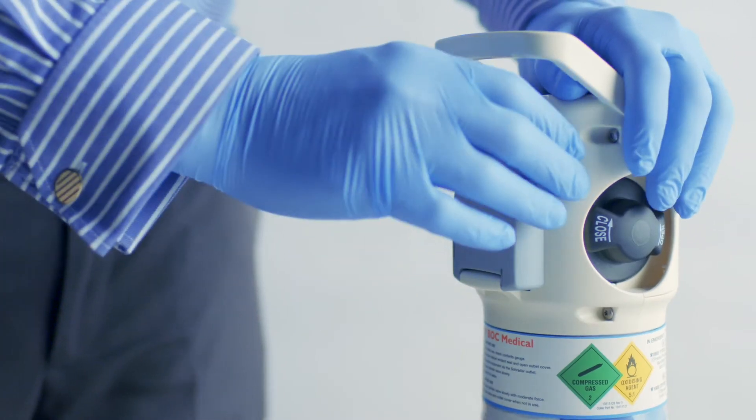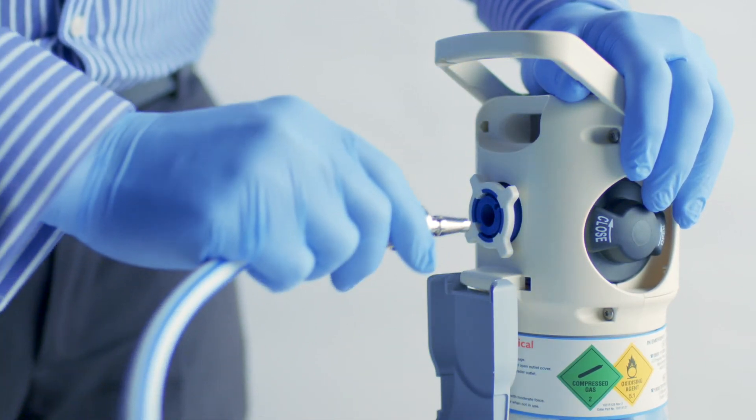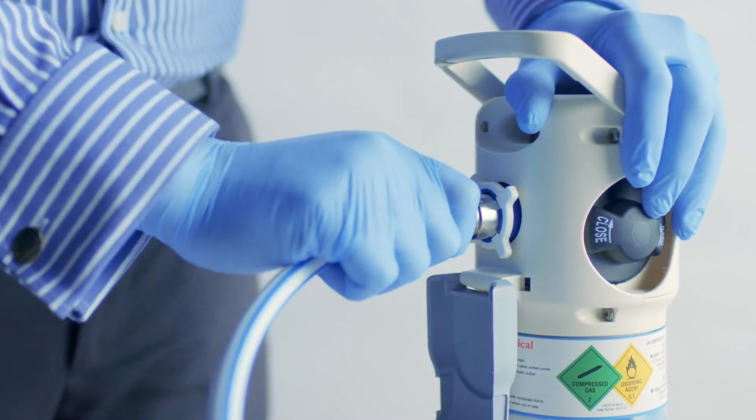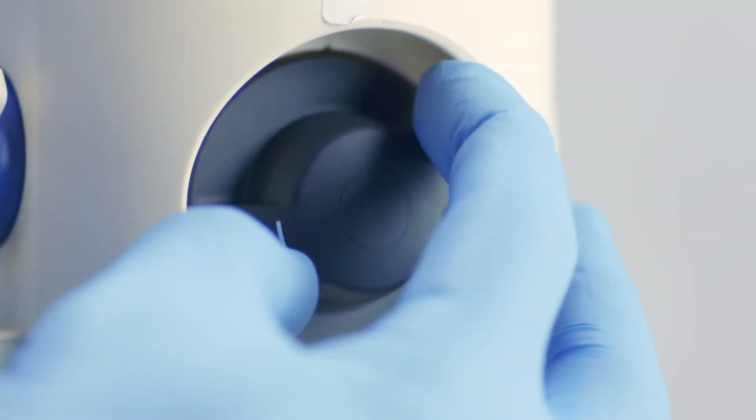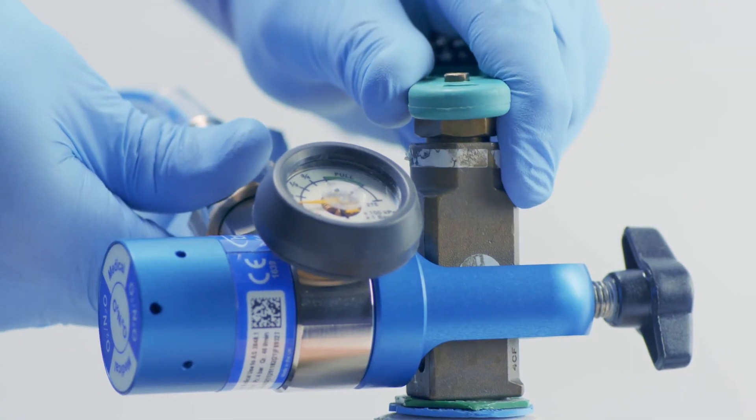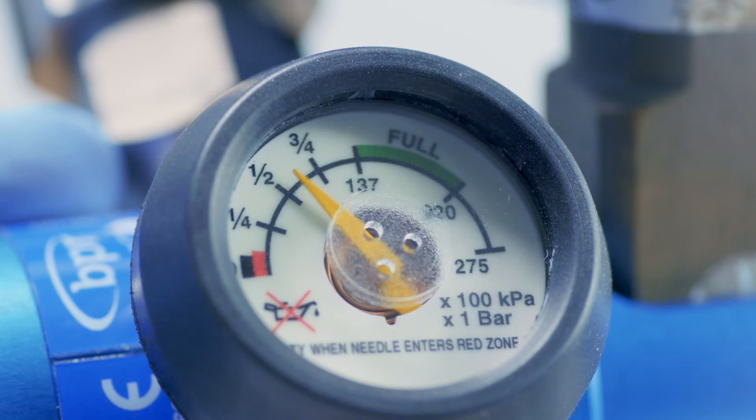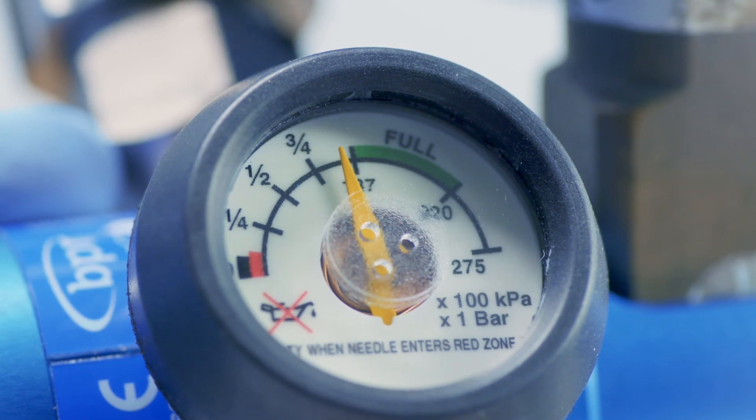Connect the demand valve probe to a cylinder or medical gas terminal unit. If using a gas cylinder, turn on the cylinder valve. Remember to monitor the cylinder contents regularly and have appropriate backup cylinders available.